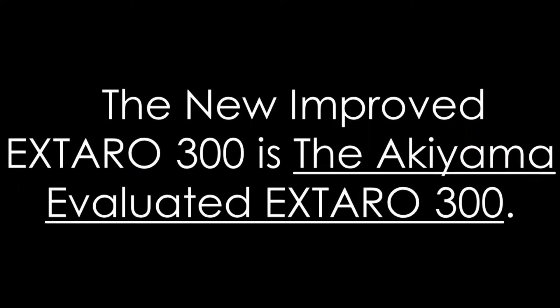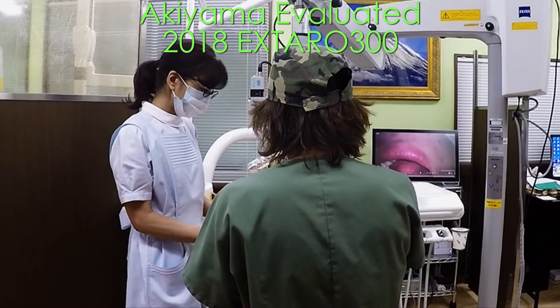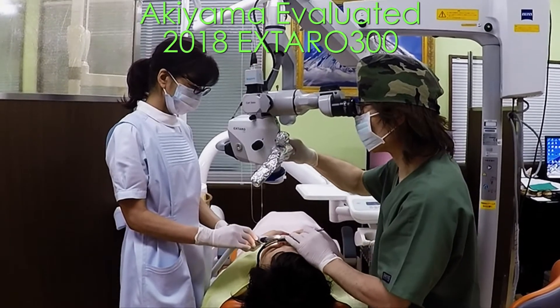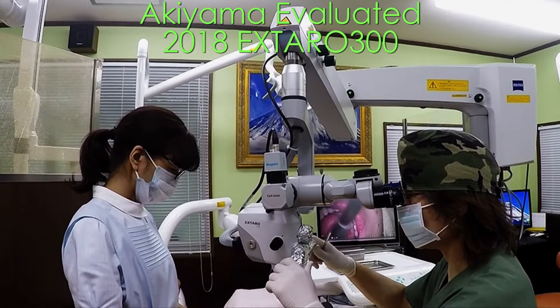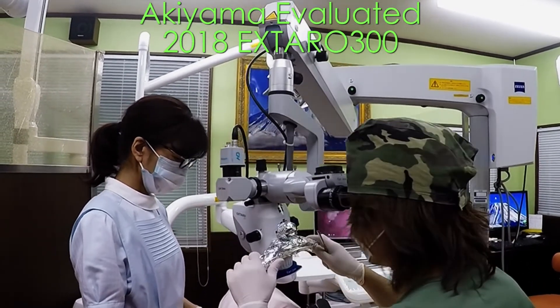The new improved EXTARO 300 is the Akiyama evaluated EXTARO 300. This is the Akiyama evaluated 2018 EXTARO 300. As you can see, it is easy to turn independently — easy to turn independently in the same place.